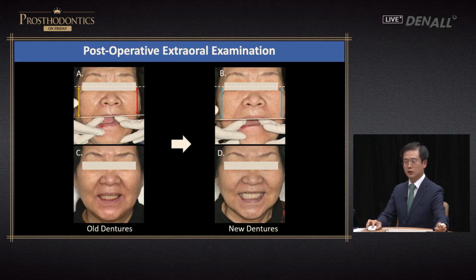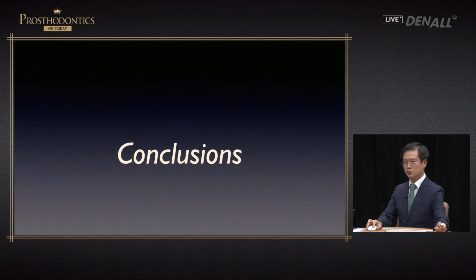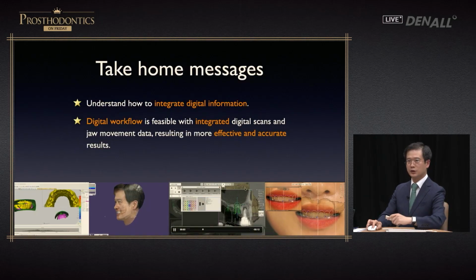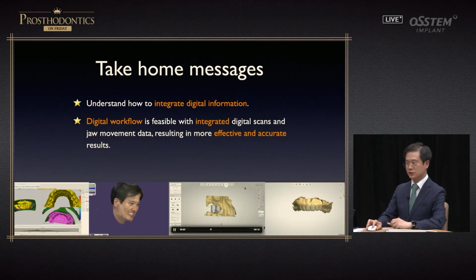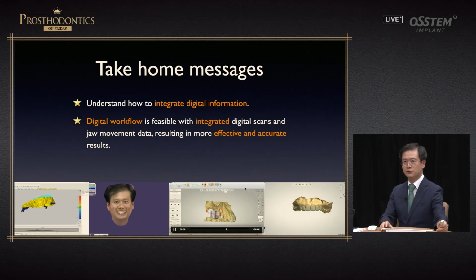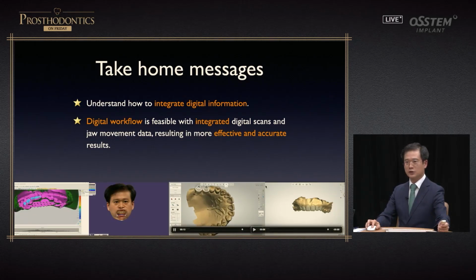To give you my conclusion, in order to figure out the patient's different circumstances, I think it is important to integrate digital data. You can utilize a facial scan and mandibular movement. Using this information, you can replicate it in the CAD software, and it's very important to utilize this.